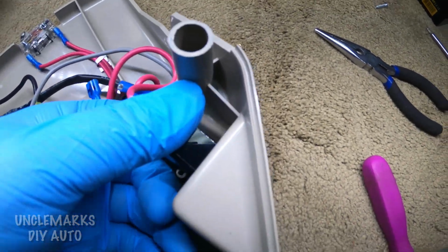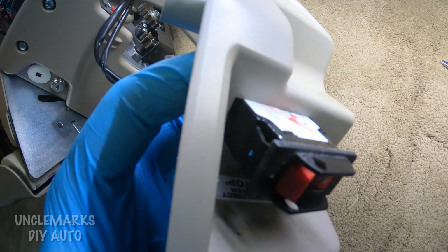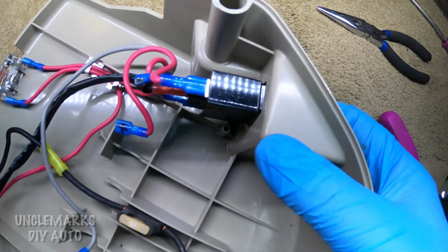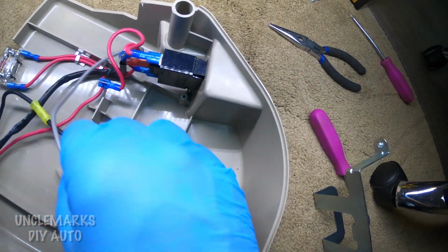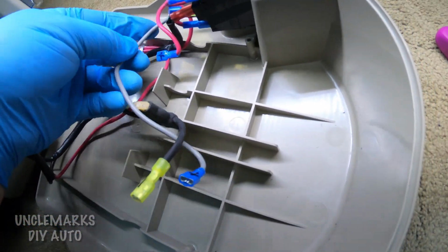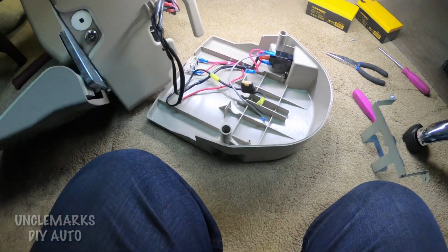You just squeeze both sides and you should be able to push it out this way. I'll show you the way the little fingers are that hold it. You can see it with it out. There's a finger on this side. You'd be pushing where my fingers are inside, and there's one on that side as well that hold it. And then you could just unplug it and then push it back in. It's kind of hard to see those, wasn't it? Make sure you have your wires here properly, not mixed up.